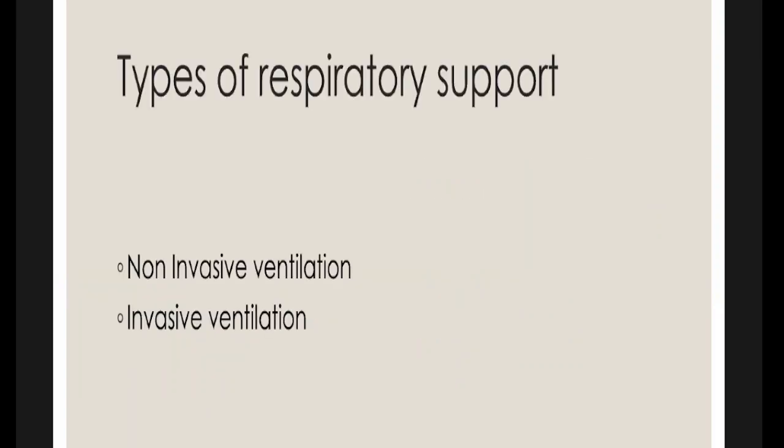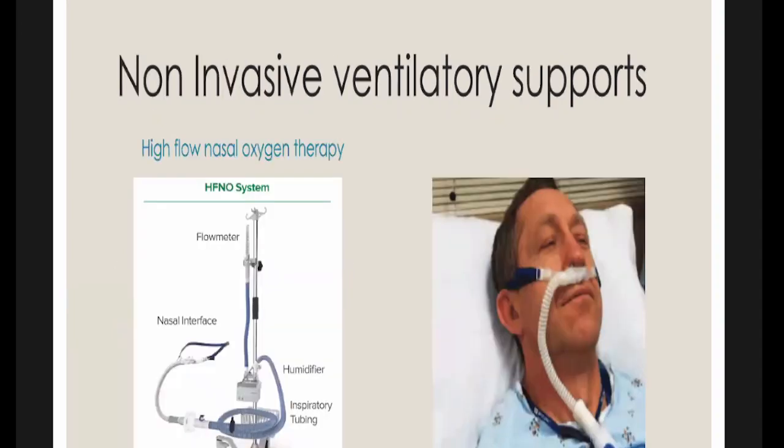We have two types of ventilator support. Basically, we have non-invasive and invasive. Let's discuss each. These are the non-invasive ventilator supports. Have you all seen this sort of non-invasive ventilator support during your hospital visits, ward rounds?